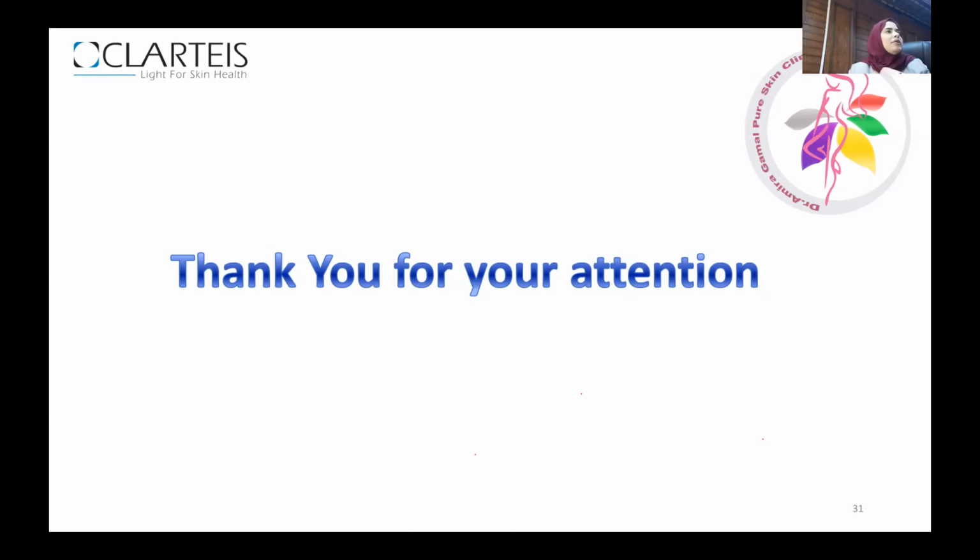My Exciplex, I think we start with it's only Exciplex, by the way. I didn't make any combination for anything. I think I started with 80, okay? Then I increased till 120 and it disappeared totally in her neck.